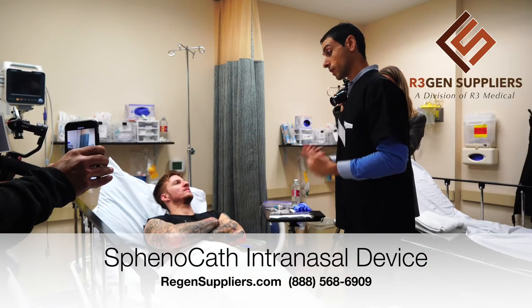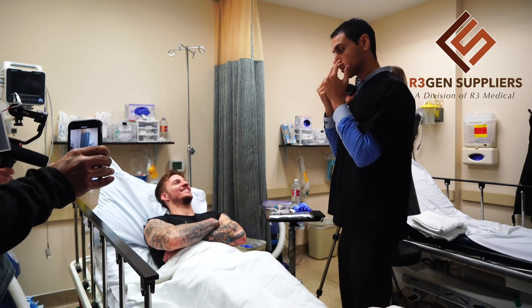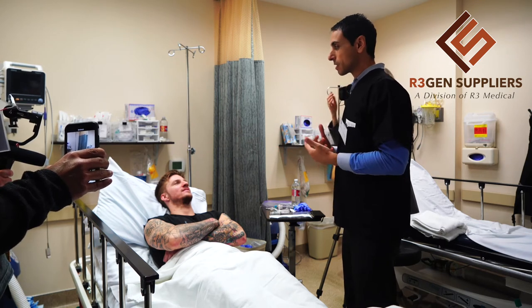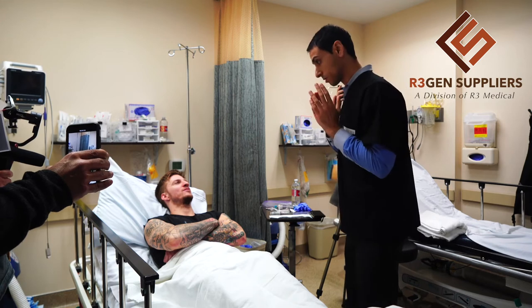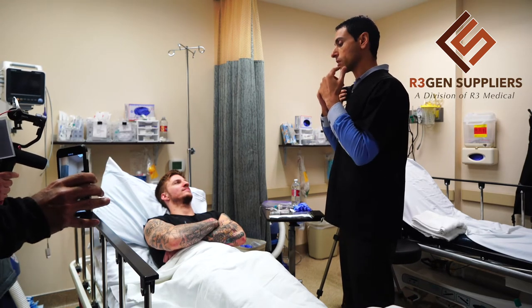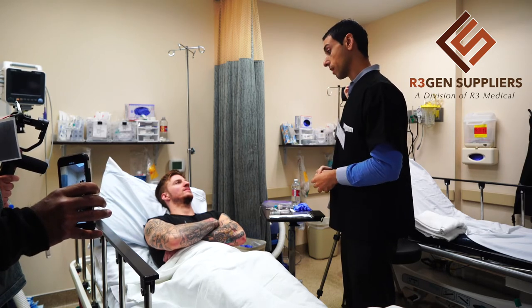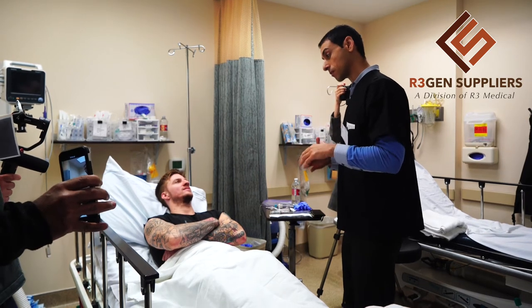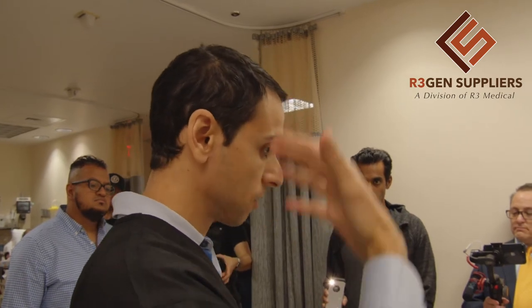Sometimes patients do this — when I had the procedure, my first instinct as soon as you feel something hitting you from the inside, especially when the stem cells are put in, that sensation is uncomfortable and the first thing you want to do is sit up. It might feel like tickling, or like you have fluids up in the nasal cavity. You want to stay for at least ten minutes with your head backwards after we're done, just to allow that to diffuse.